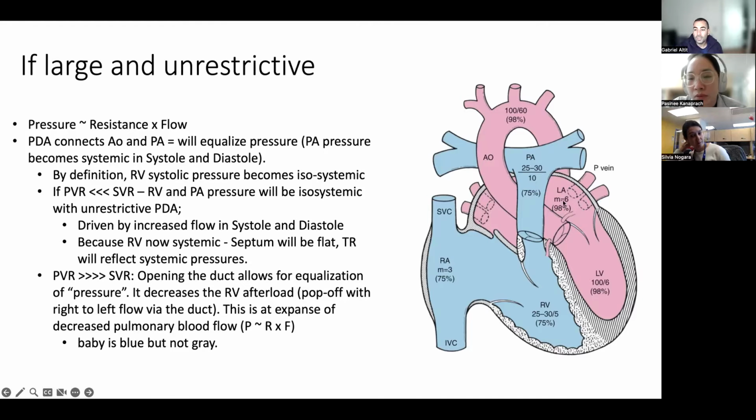Well, the pressure here should be the same as the pressure in the vein, right? And ideally, it should be the same as the diastolic pressure, because when the valve opens here, this pressure and this pressure should be the same.